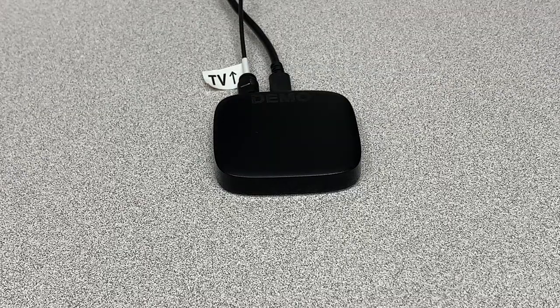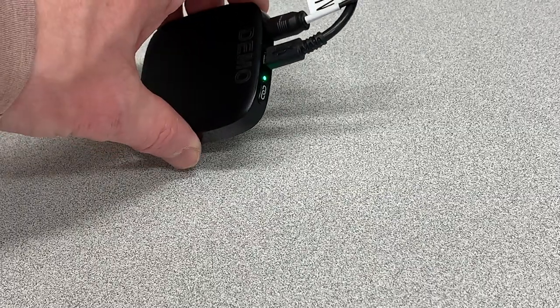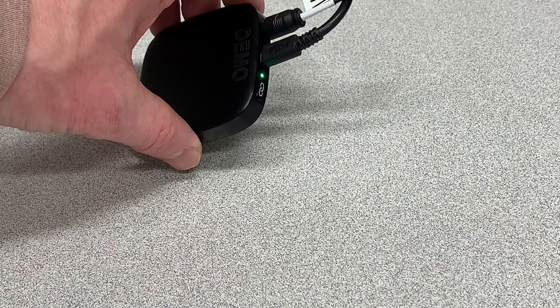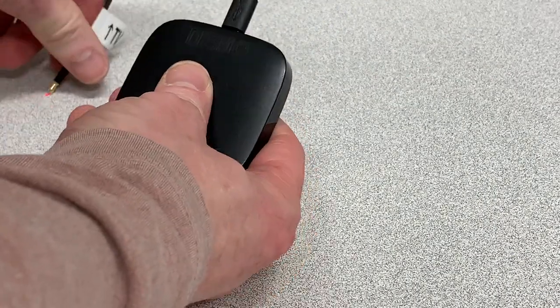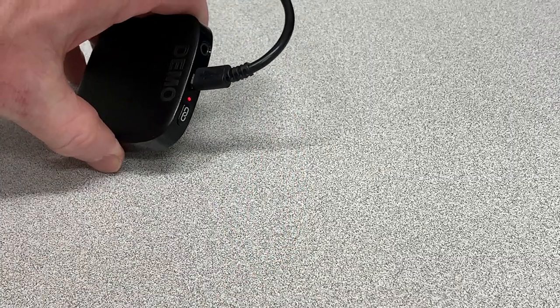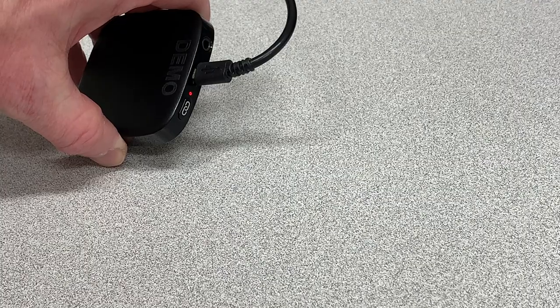Now that we're hooked up to our media source, on the back you'll notice a green light indicating that we are actively connected. If I unplug the fiber optic cable, that light changes to red indicating that we are not connected to that audio source any longer.